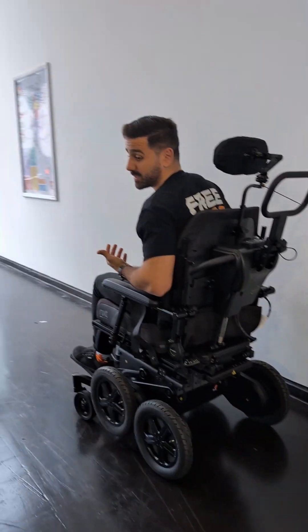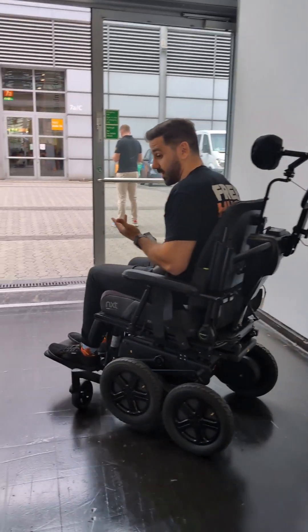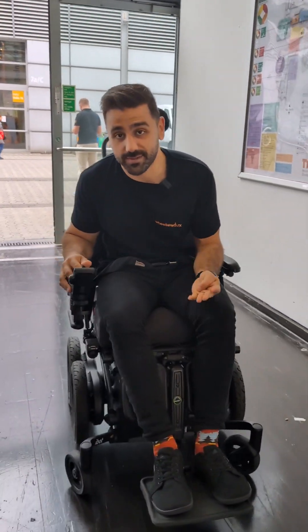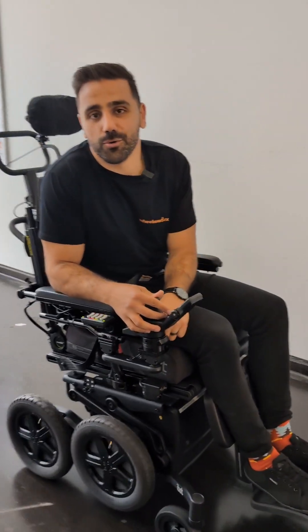So basically it's a chair that allows you to climb curbs, climb stairs, pretty compact when you go indoors, you've still got your power seat functions, and you can put rehab seating all over it. What an awesome chair.